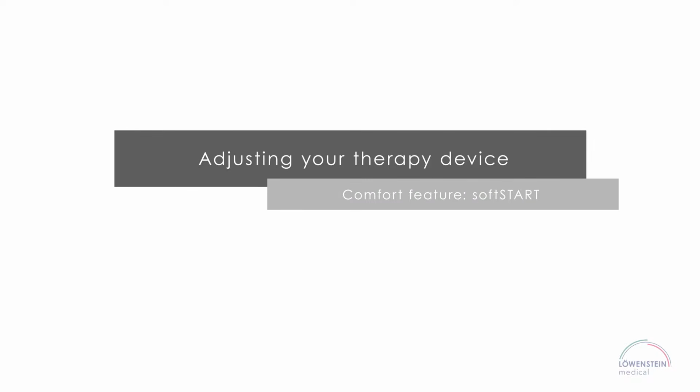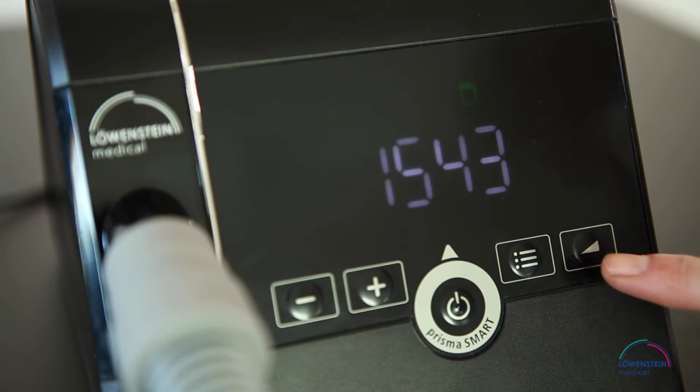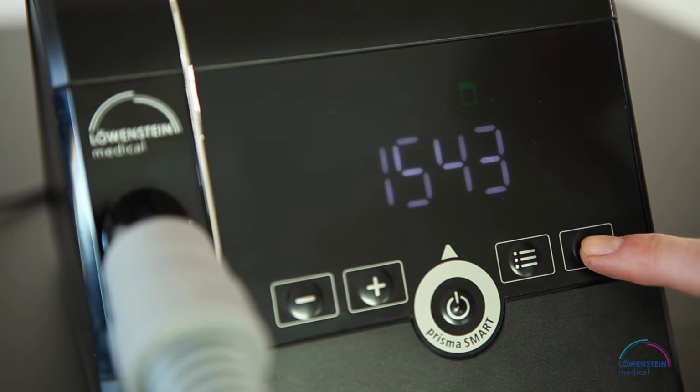Now I would like to explain the most relevant symbols and menus of your therapy device. Here you will find the softSTART function.